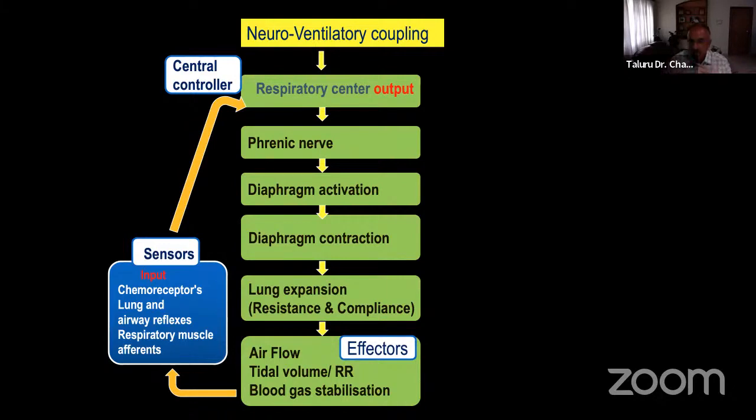So in the way we ventilate, in most of the common basic modes, there is an inherent small delay from the respiratory output to the ventilatory input. That is what you have to consider. But it is very, very small. In most cases, it may not cause asynchrony, but in sick patients who have a lot of fever, tachycardia, tachypnea, these are the patients who may have asynchrony because of this. From the output to the diaphragm contracting, air being sucked in, the ventilator being told that the patient requires a volume, and the inspiratory flow starting, there is an inherent problem.